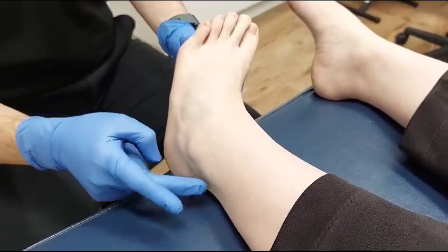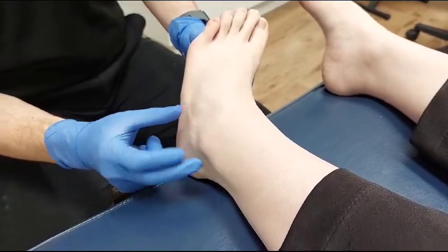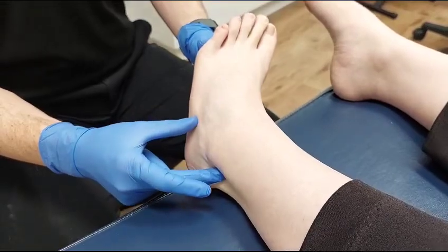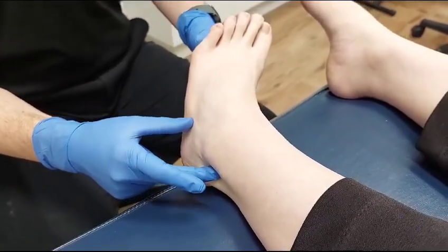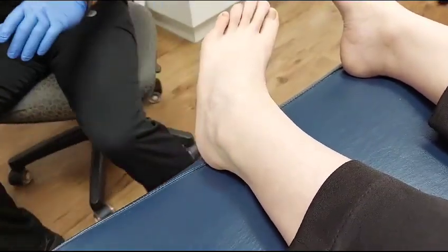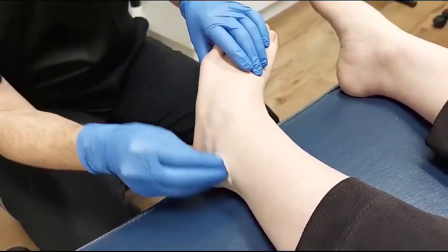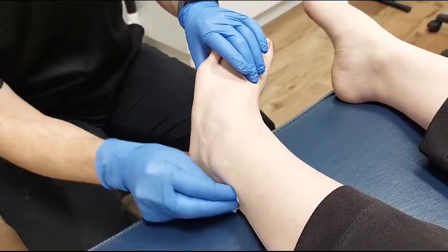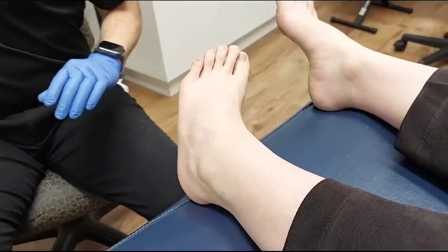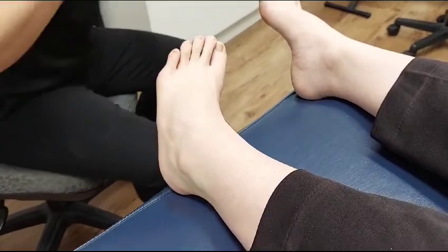Achilles, peroneal — we're just going to get in there. We might get some skin tension when pushing it across, so that's going to be our injection site. Also, we don't want my model here to be limp-footed, so first thing we do is get our alcohol pad out and give it a nice clean. One thing I do recommend: put some eye shielding on.